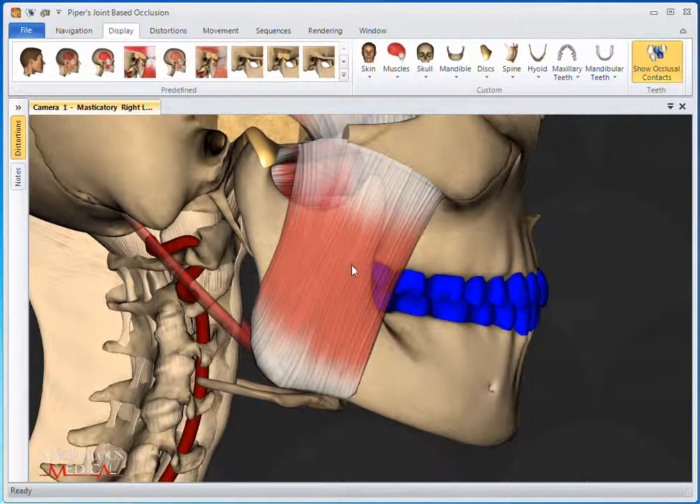As you can see, all of the teeth have now turned blue because they are all contacting. This feature is best demonstrated using a sequence.